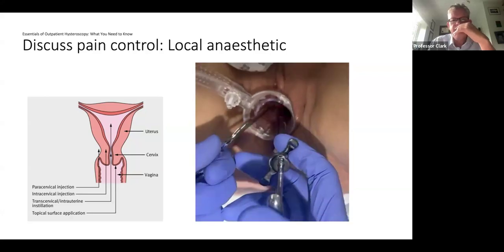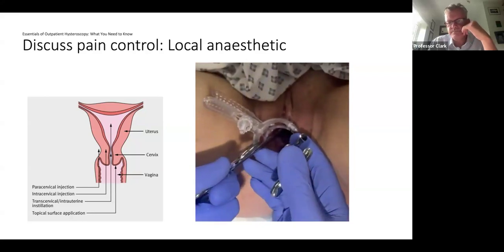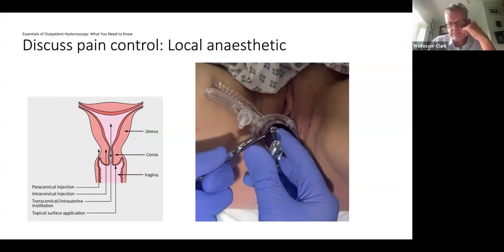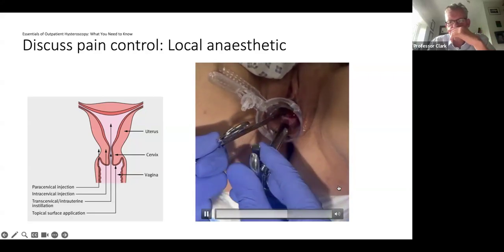It's a little bit difficult to access. This is going down at 6 o'clock, sharp scratch, not very pleasant. So start squirting as we go forward. We can't aspirate with the dental cartridge, but you can put the majority of that, again, full depth, and out we come again. See the needle coming out.